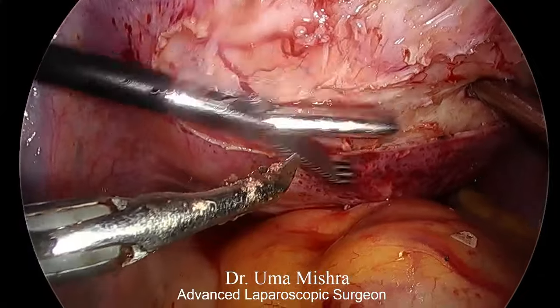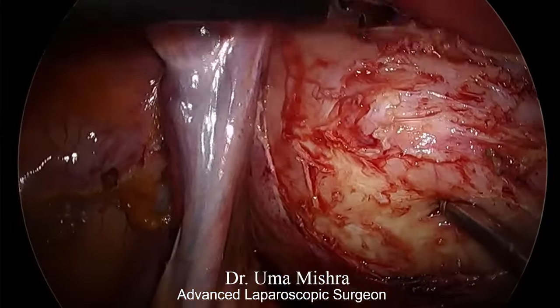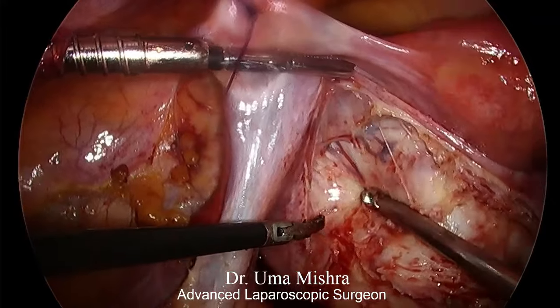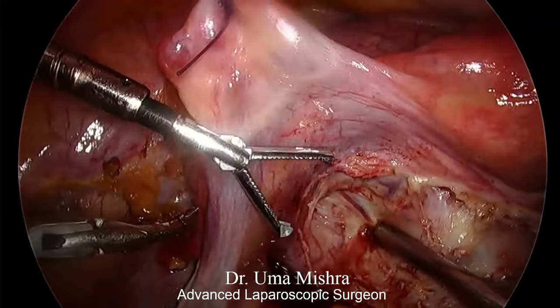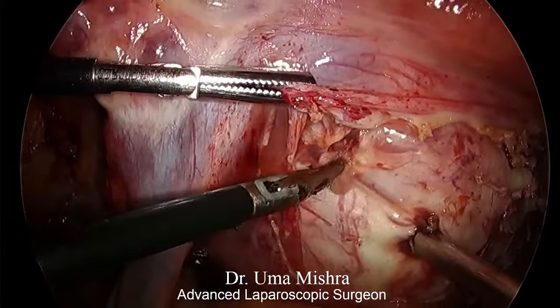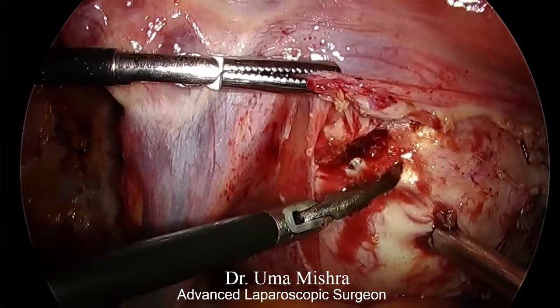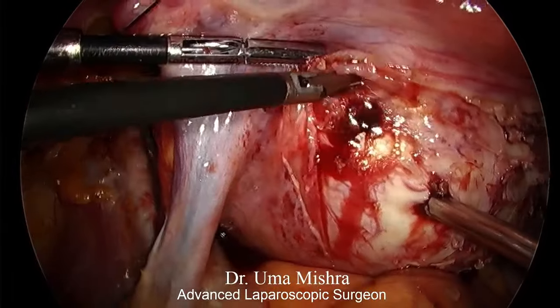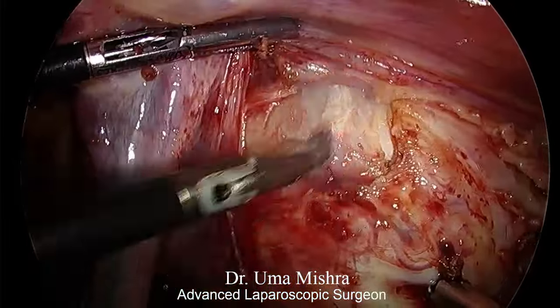Being an ipsilateral surgeon, keeping suturing in the mind, I have taken a transverse incision. Some surgeons comfortable with suturing with the middle port and contralateral suturing, they can opt for a vertical incision over myoma and can excise it and suture it.